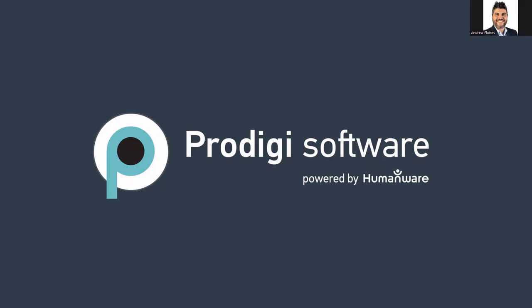However, I do see that about a third of our attendees right now, this is their first experience seeing Prodigi for Windows. So I'll do my best to give a gist of what the software is about and point out some helpful resources where you can learn more.